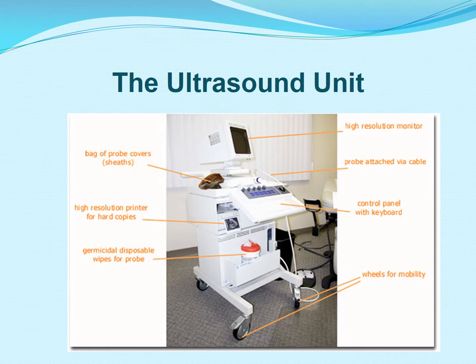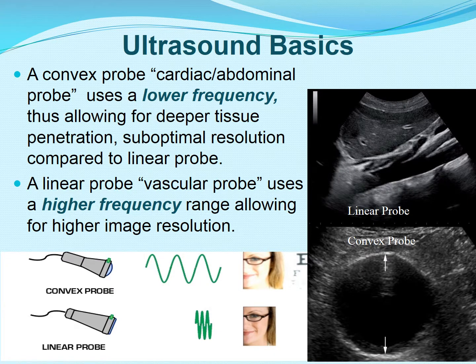The ultrasound unit. Before modern point-of-care testing, portable ultrasound units were developed. If you see here, it's a large and very cumbersome device. Nowadays, we have handheld pocket-sized devices. Also, the surface area for this device can harbor large amounts of bacteria, and it's very cumbersome to bring into patients' rooms.